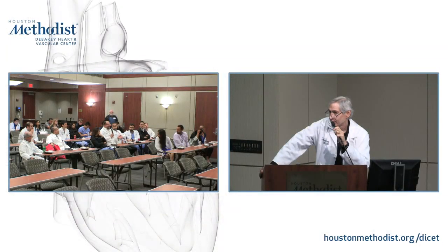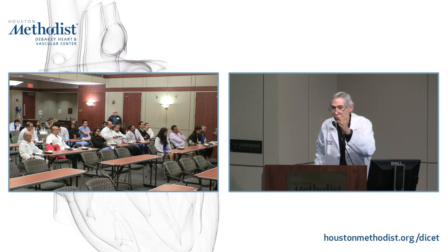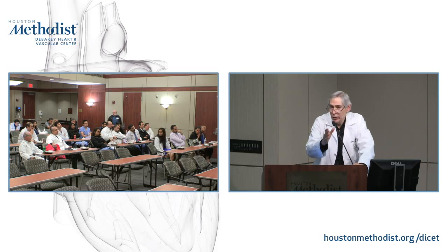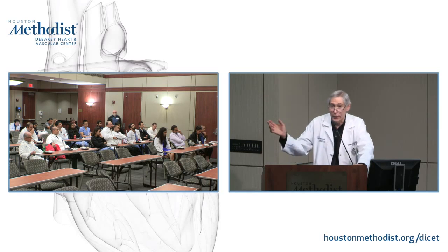It's really kind of a funny circumstance. It's not very clear, and that's one of the reasons they're doing the second phase 3 trial, because of the specificity issue. One of the problems with the way they design these studies is that if everyone gets cath, that's one thing. But if you cherry pick who you cath based on perfusion results, you're going to bias yourself into a lower specificity. You can't avoid it.